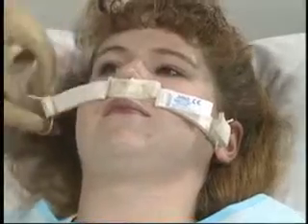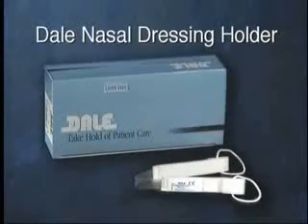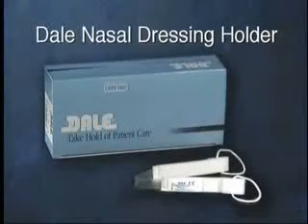The nasal dressing holder prevents skin irritation following nasal and sinus surgery, simplifies dressing changes, improves patient comfort, and saves nursing time. The Dale nasal dressing holder allows you to take hold of patient care.